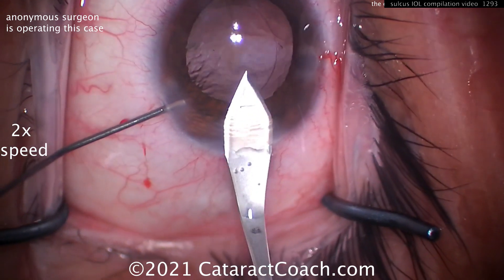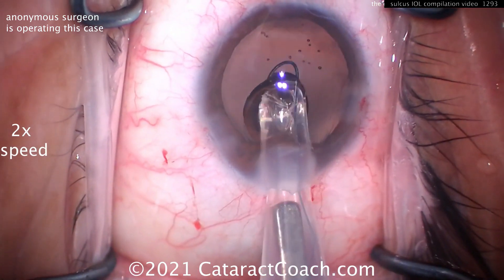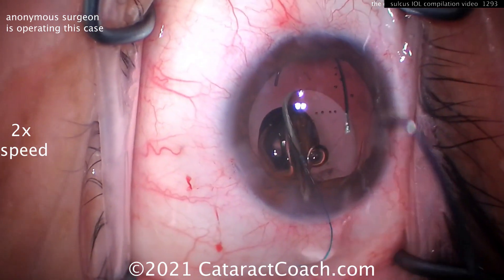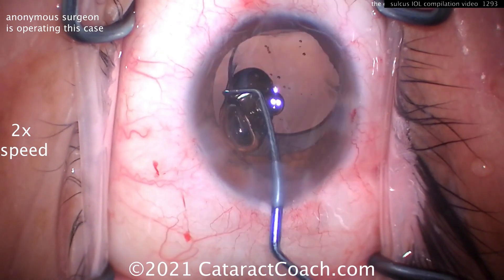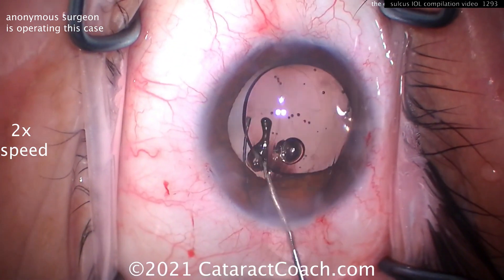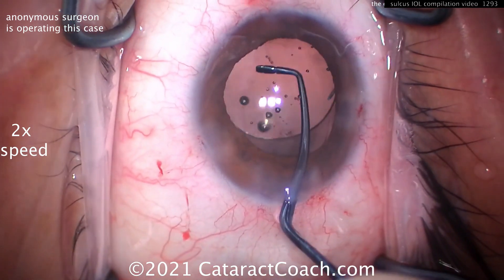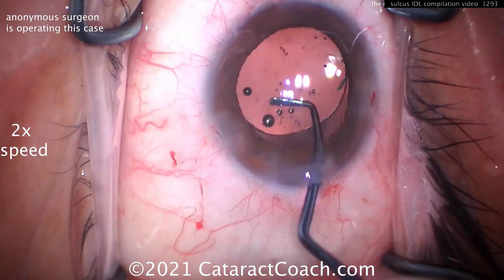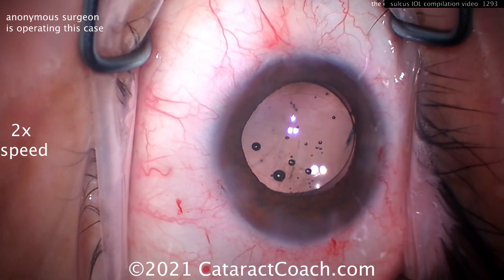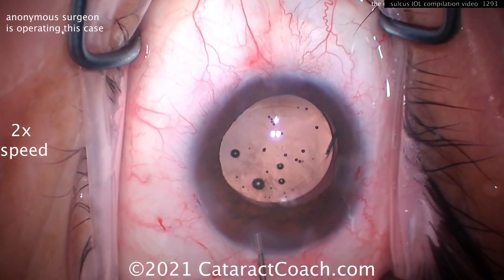Sometimes you need to open your incision — a sulcus lens may require a bigger incision than your standard single-piece acrylic going in the bag. Here's a bigger incision; we'll deliver that three-piece acrylic lens carefully. A good easy step for beginners is to place it on top of the iris first, then carefully dial it into the sulcus. Make sure those haptics don't go too far posterior — you want them between the anterior capsular rim and the back surface of the iris. If you're not doing optic capture, bring the pupil down with constricting medications.